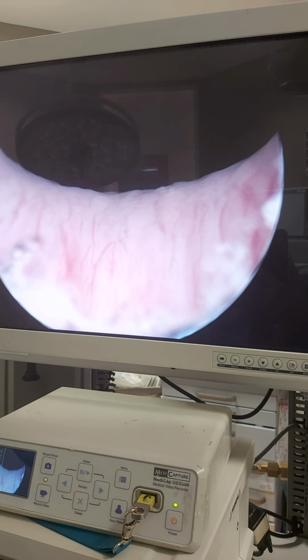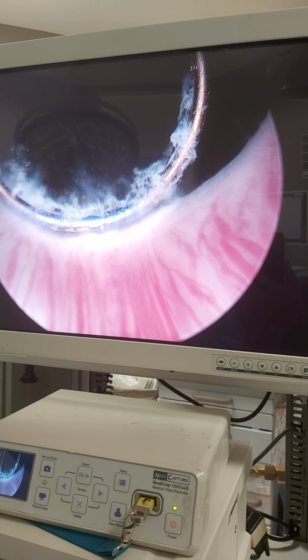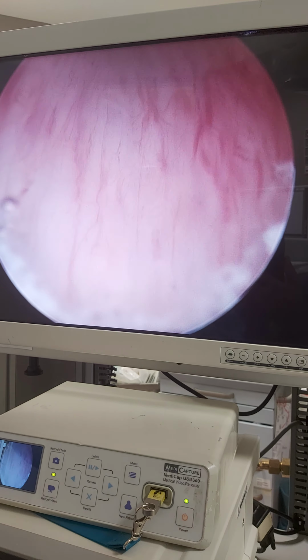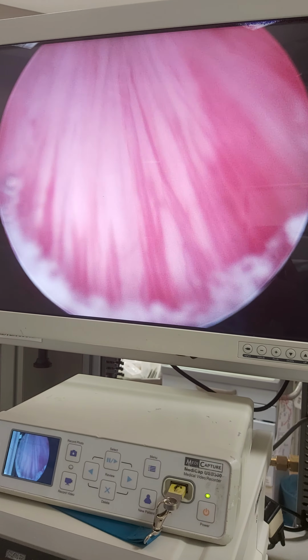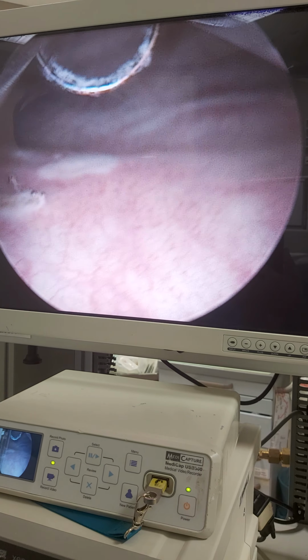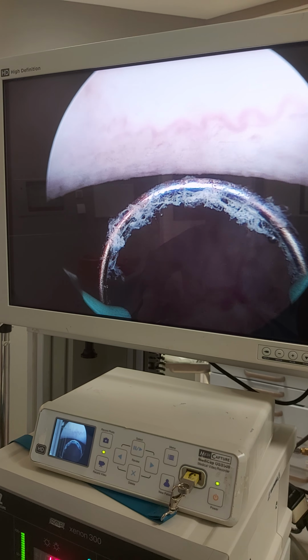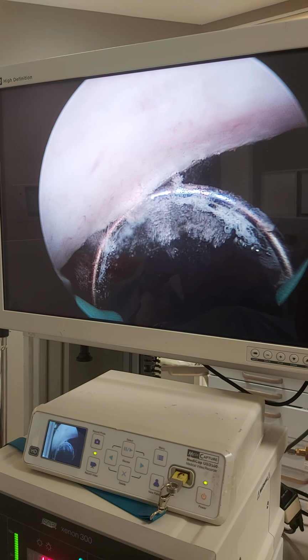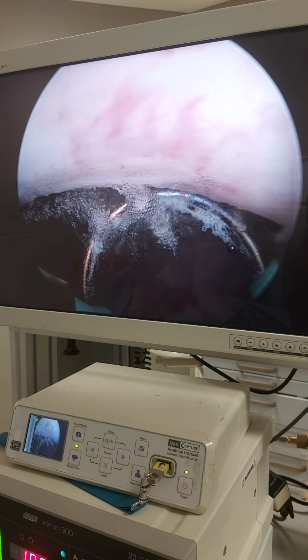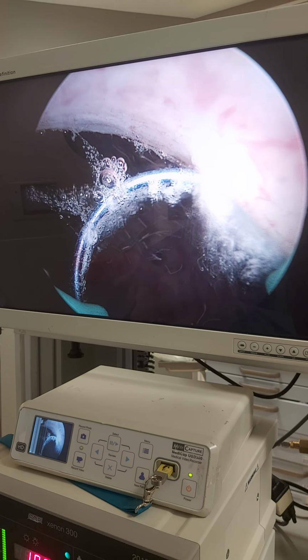And in the bladder neck, I can see tissues here. This is my border. This is urethra. It seems normal. Look at all this triangle beautiful way. And the upper part is also important part. In ultrasonographic view, we see some differences here, and although it's not very recognizable with endoscopic view, I am fulgurating these parts. I don't want to leave any suspicious tissue behind.